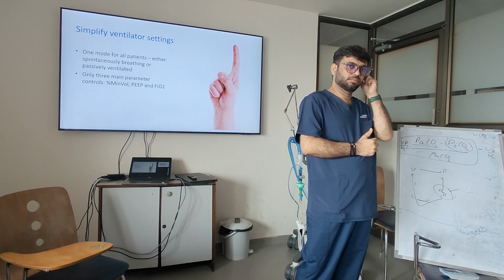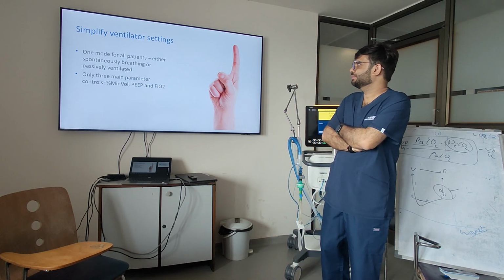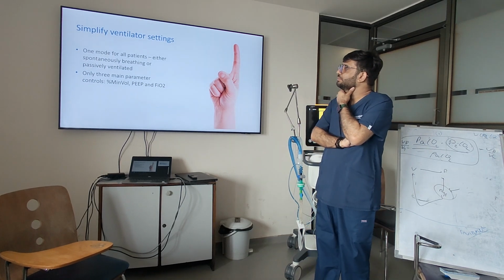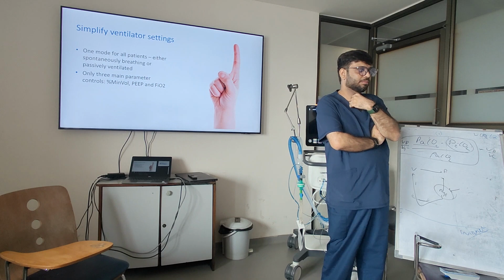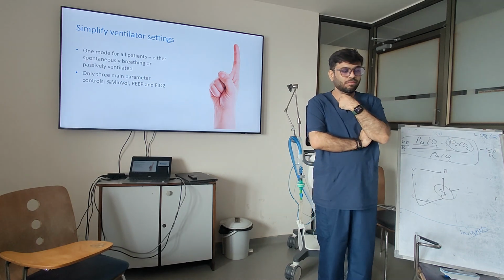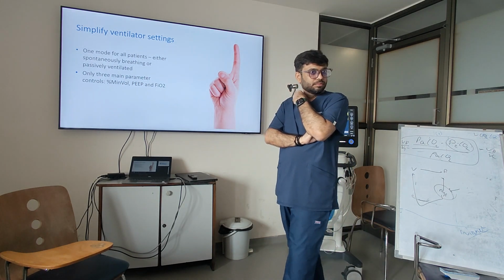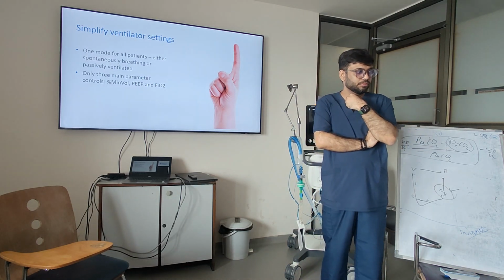And then subsequently, what did it do? It went into readiness to meet criteria. It told you it has been on spontaneous for a long time. Then it did an SBT. After it did an SBT, it came and told you to remove the ventilator. And during the SBT, it gave you all the parameters, saying, is your RSBI okay? Is your tidal volume okay? That's the background of what we did recently. He'll explain to you how he did that. You understand the background of how that patient did? Now he will tell you how the ventilator did that.